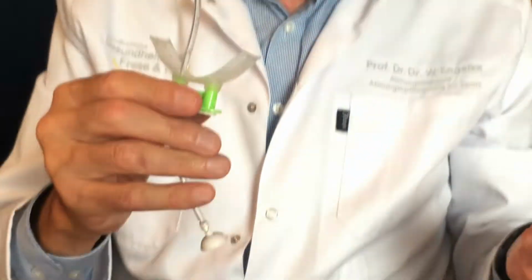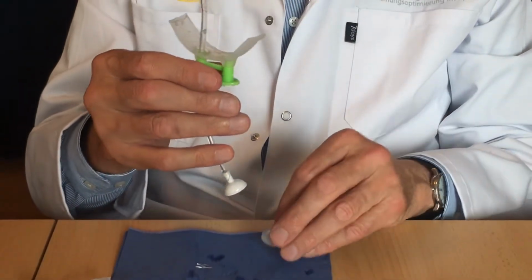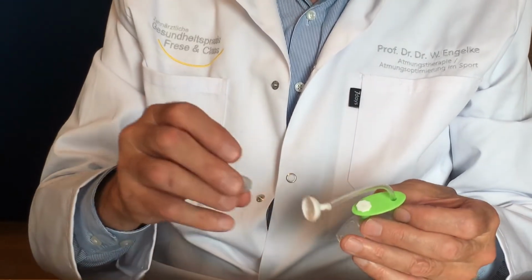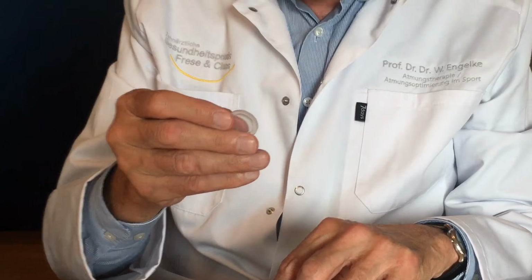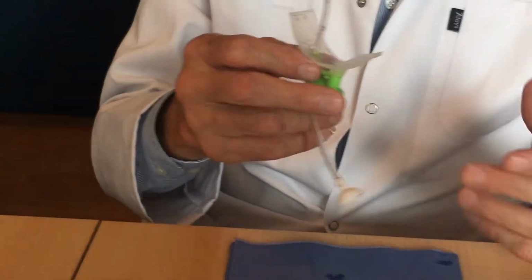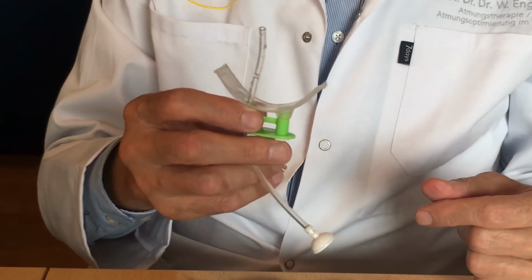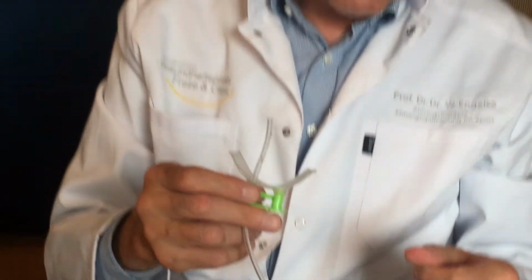And that's the difference. When we pull the device after removing the membrane, it can be pulled out easily. And now we'll show what exercise can be done without the negative pressure. This is the exercise which also is recommended with other devices.